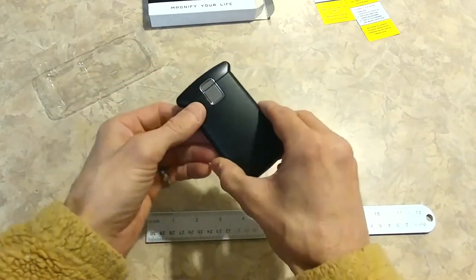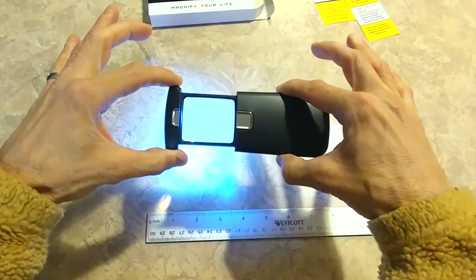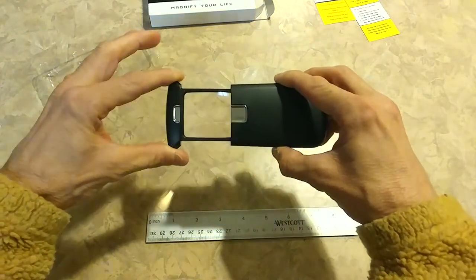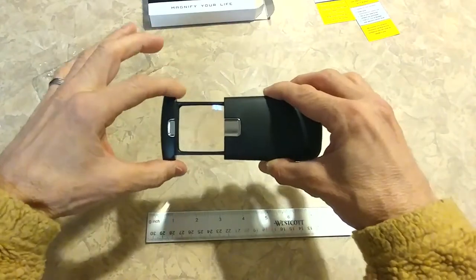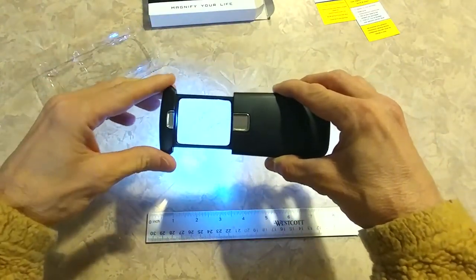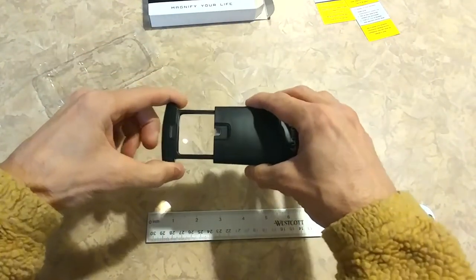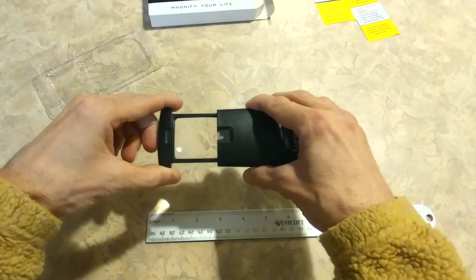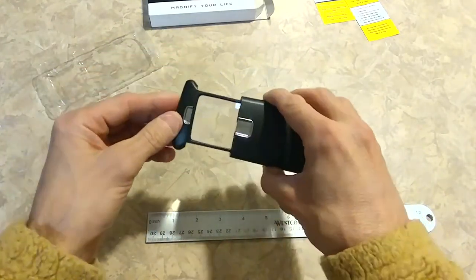Very simple device. Out of the box, it works. You pull it open enough and the light turns on. You don't have to have it come on — you can go almost all the way open on the lens, and then all the way, and the light comes on. Really bright. It shows up well. Really simple to use. Three times the magnification — three times what you see.